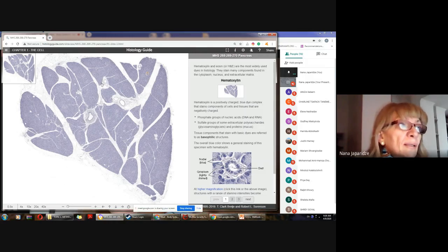Besides this, you can see these dark stained lobes of the tissue, they are a parenchymal part of this organ. The parenchymal part usually contains this specific type of cells which accomplish the function of the organ.